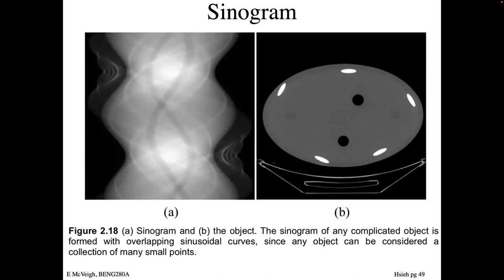So to look at convolution back projection and how you actually reconstruct the true object, not from the naive back projection, they're very closely related. We're going to take a look at the raw data, and we can organize the raw data, g of L and theta, into what's called a sinogram. A sinogram is a set of the measurements, and they are stacked so that we plot theta in one direction and L in another direction. As we accumulate different theta, we just stack them up as a function of L and theta. And so that function there is called the sinogram.